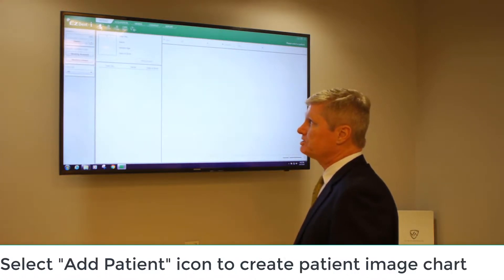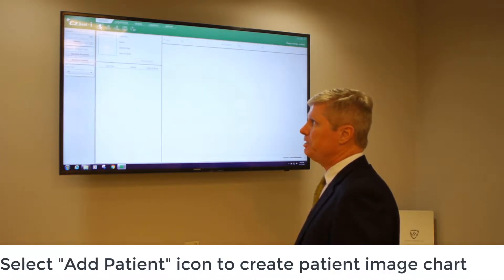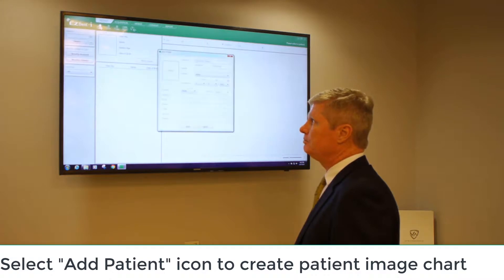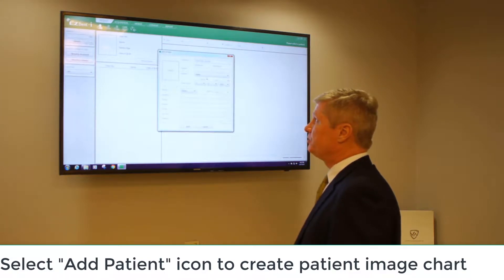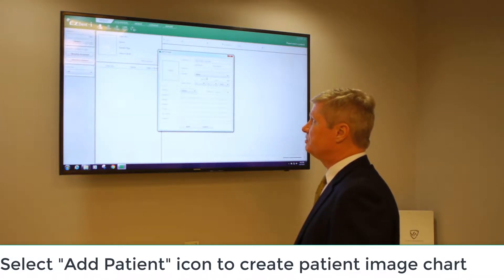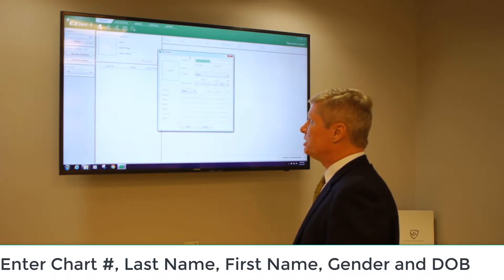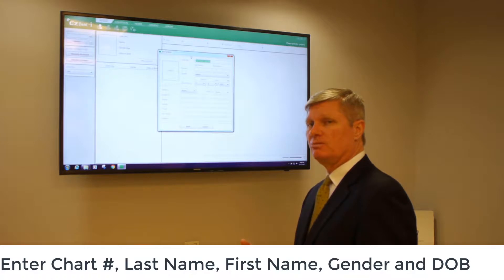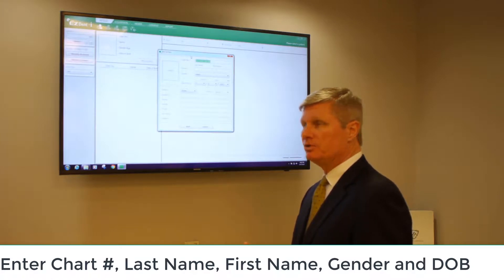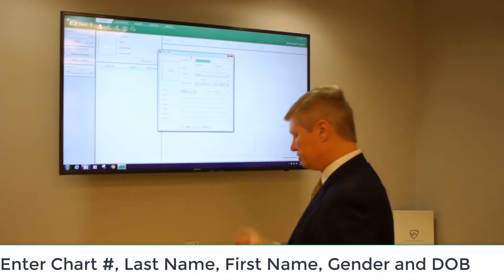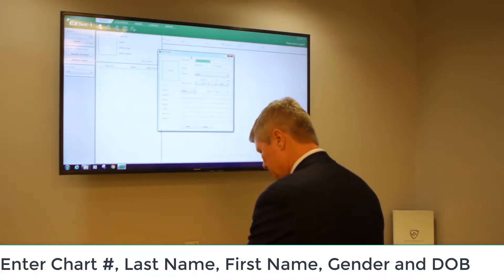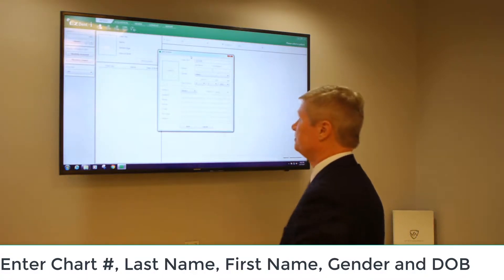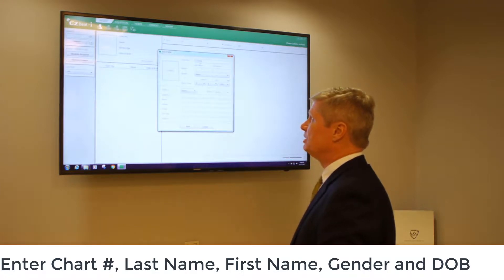Click on the plus sign here next to our patient add button, and then enter in our patient information. Beginning with our chart number — we can either use the automatically generated number or enter in a custom number, so it's 1, 2, 3, 4, 5, 6.